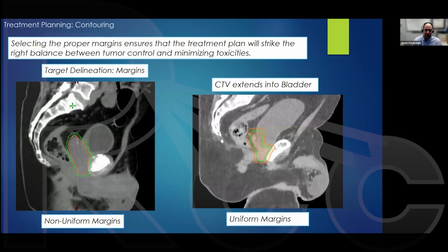But that also accounts for the fact that we have high quality cone beam imaging, so we can see where that border is, and that at treatment, the therapists are given the instructions to match along that anterior rectal wall. So that is the point that we're ensuring, or at least verifying, is in the correct position, because we know that margin is reduced. I think hopefully that answers the questions. But 3 to 5 is fairly common across the field for prostate. Yes, and you emphasize the important point in combination with daily cone beam.